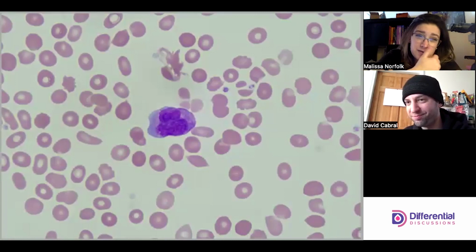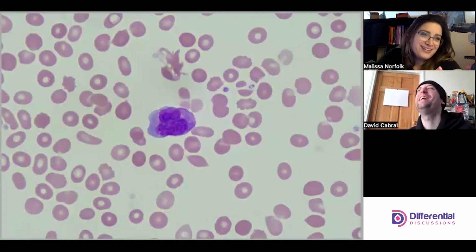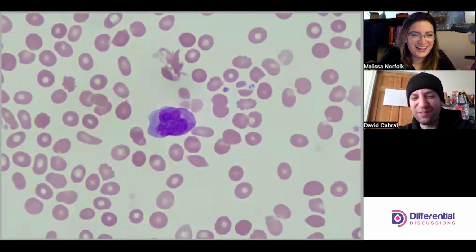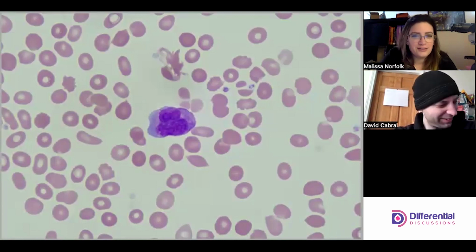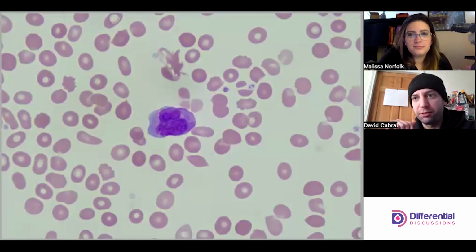Monos don't usually do this, but malignant cells don't read the textbook and say, I shouldn't do that. That might confuse Dave and Melissa. That would be nice if they did that, but they don't. So we're gonna look for more butterflies, right?